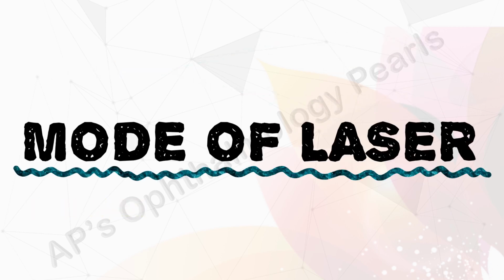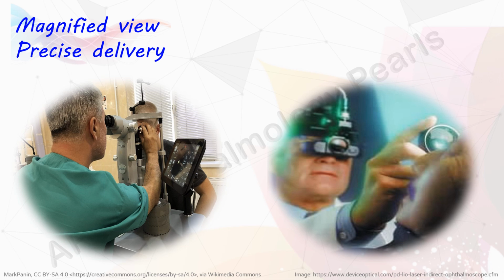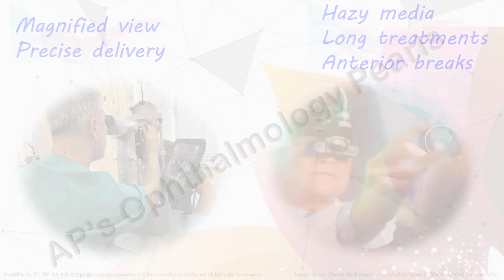Laser may either be delivered via the slit lamp or by laser indirect. Slit lamp delivery allows a magnified view and more precise delivery and is useful in clear media. Laser indirect is useful in hazy media, for long treatments because of positioning, and in very anteriorly located breaks.